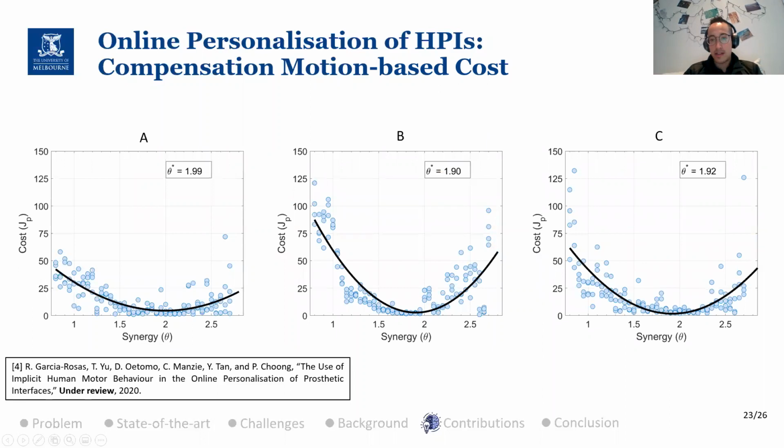So we designed that measure of performance using these two metrics, the trunk and shoulder displacement. And we get this map between that new measure of performance, which, since we are now trying to minimize the compensation, because that's what we tend to do, we'll just call a cost. We do see that even though it's a bit flat in some parts, on average we get the convex behavior, or concave behavior, that we would like.